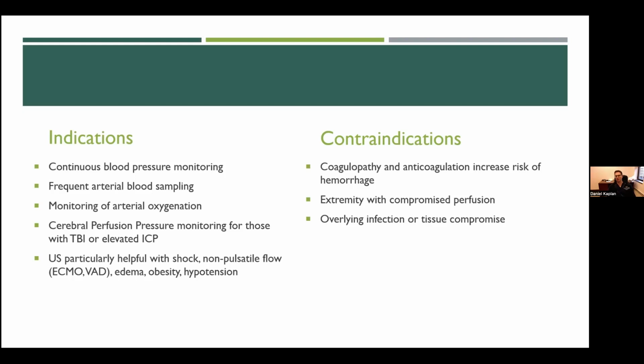So indications: continuous blood pressure monitoring. Anyone on a cardene drip or some sort of antihypertensive medication where you want frequent blood pressure monitoring, or vice versa if they're on epinephrine or another vasoactive medication. Frequent arterial sampling, so if you want frequent blood gases, monitoring of your PaO2, as well as patients with TBI and elevated ICP.